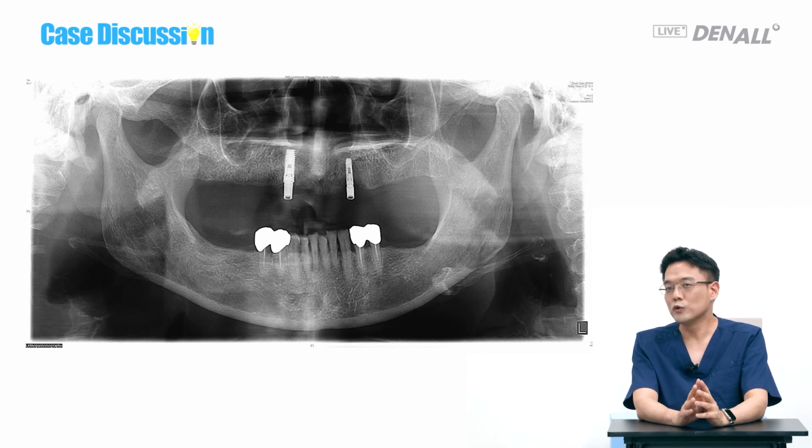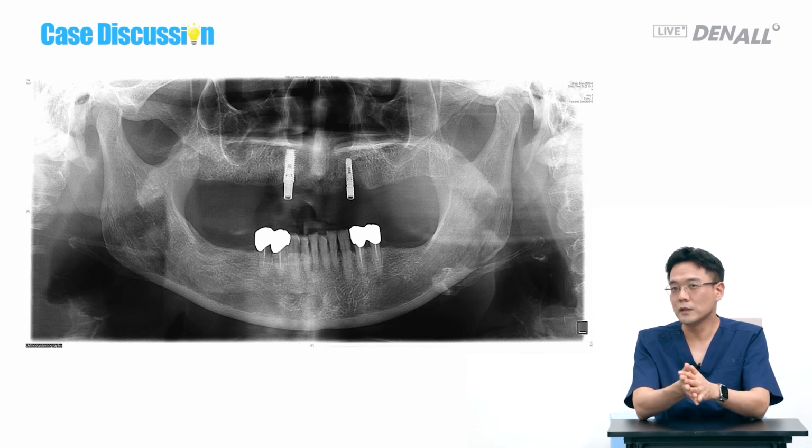I work with the prosthodontists and I get ideas from them, so there can be many ways, and I hope the dentist who sent us the issue considers many different options, and we shouldn't be obsessed about using the implants placed there. They can be in a sleeping status, or we can remove them. So in this case discussion, we talked about prosthesis to maintain lip support of a maxillary edentulous patient.